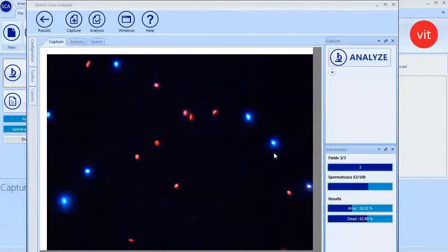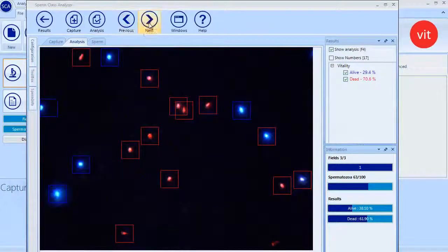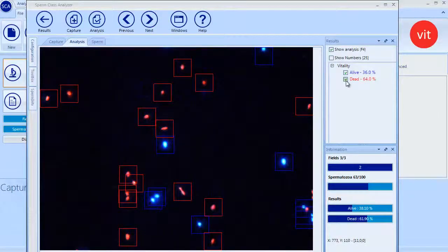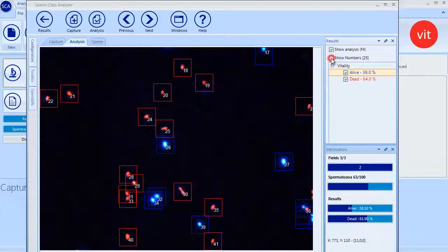All captured images are displayed in the analysis tab. Marking or unmarking results checkboxes, we can display or hide the spermatozoa of the vitality analysis. Main analysis information is always present on this side.